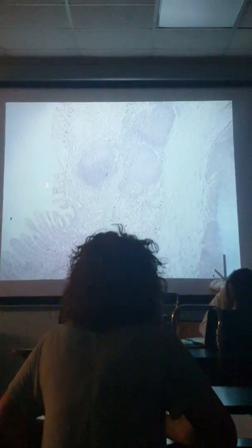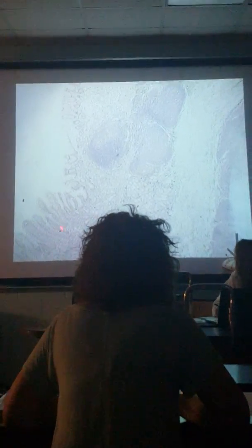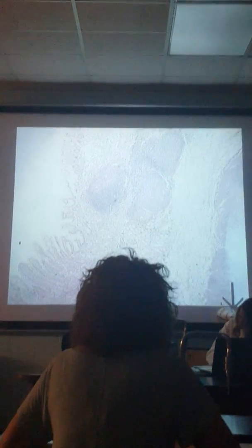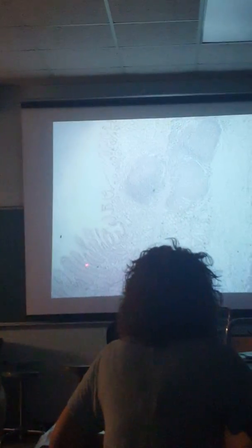So we're looking at that, then all of a sudden, look at this. What are these finger-like projections? These are villi. The epithelium is arranged in a villus formation. That gives you a heads up that the epithelium looks different. We go from really short gastric pits to really long finger-like villi, so we know something's going on here. There's a transition from stomach to small intestine.